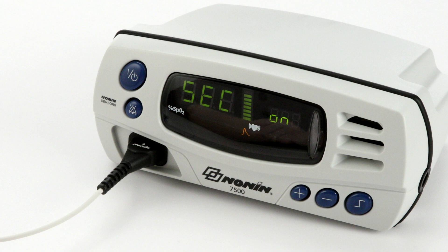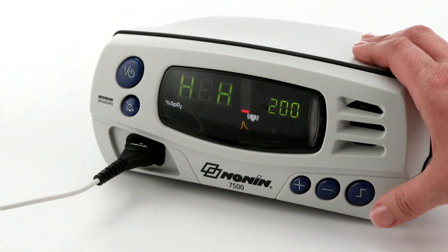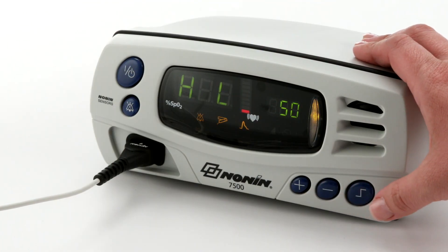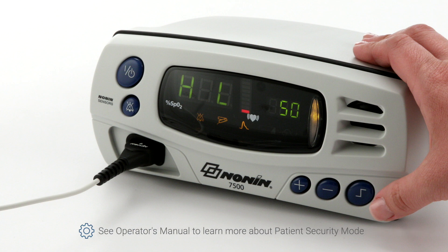When the model 7500 is turned on in patient security mode, SEC ON is displayed in the display area and three informational tones sound. The upper alarm limits are then displayed, followed by the lower alarm limits. Refer to the operator's manual to learn how to set or cancel patient security mode or reprogram settings.